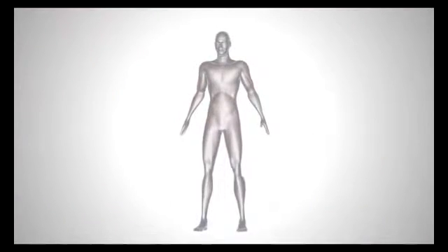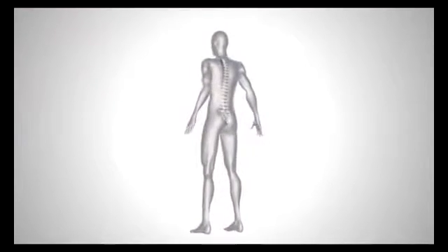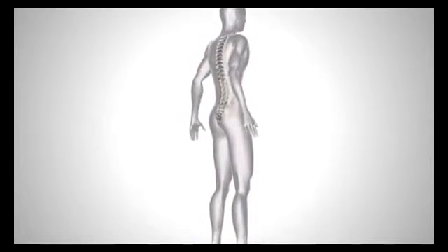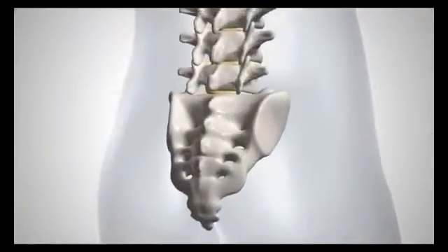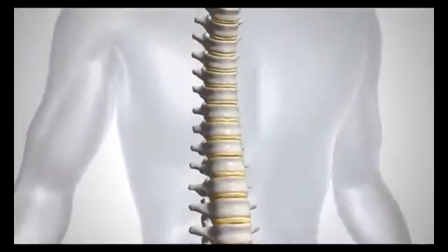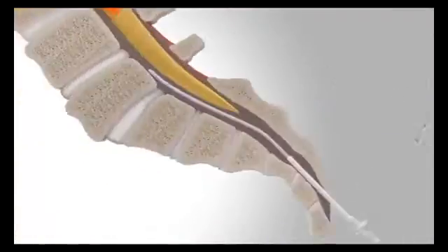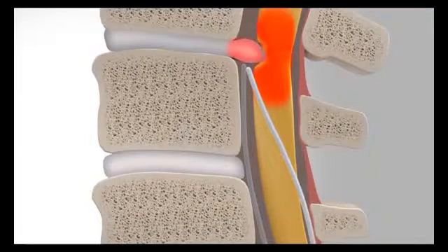It is one of the frequently asked questions about SELD. Imagining our body in 3D brings you to the right way for a successful SELD. There are a few surgeons who insist on the ventral trajectory, which makes it time-consuming for nothing. It is because the surgeons tend to imagine our body structure in 2D of AP and lateral, not in 3D. When the approach of the catheter is mentioned, to say the approach to the target point is more reasonable than to say ventral or dorsal approach. It is important to get to the correct target point, not the ventral or dorsal approach.